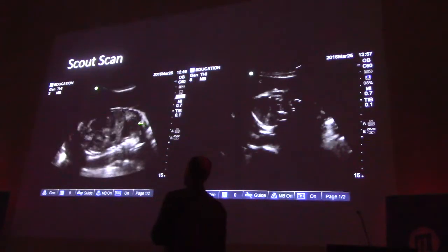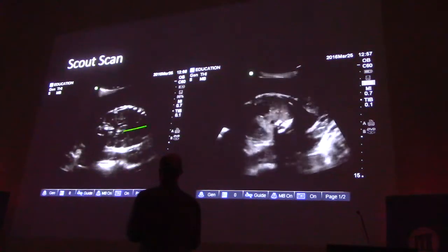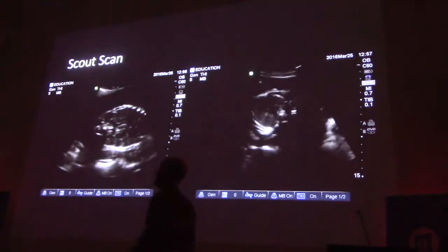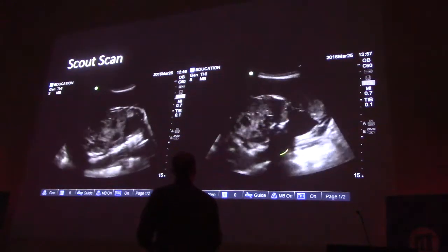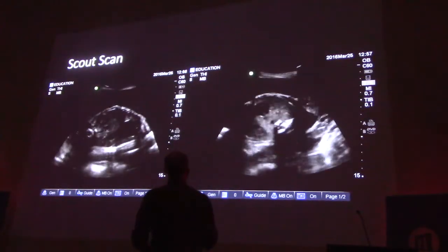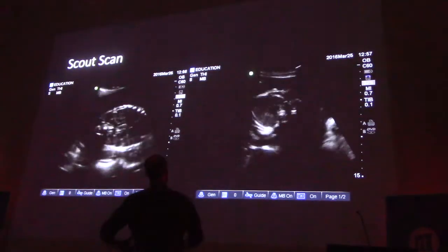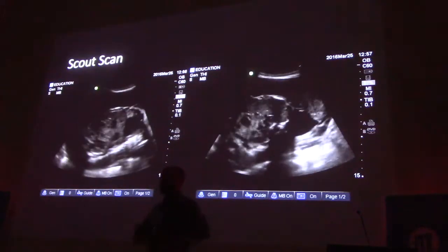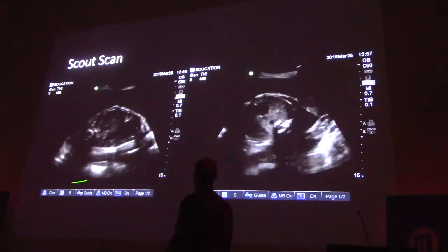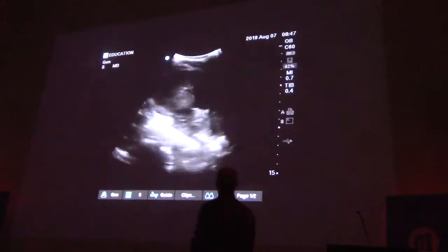You can't see a fetal head. It's down in the pelvis. But in general, if the heart's sort of in the upper part of the thoracoabdominal compartment, then you're implying that this is a cephalic presentation, when the head is down in the pelvis. Transverse, we see a little bit of placenta over here. So we know that it's fundal here and kind of on the left side. The placenta is sort of fundal up on the left. We think we see a single gestation, and there's cardiac activity. So instantly, we have a ton of information here.